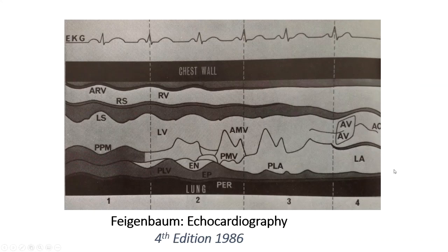And in the 70s, when I was a medical resident, this is what an echocardiogram was. If you ordered an echocardiogram, you got 4 strips of strip chart paper, one that went through the left ventricle, one that went through the valve, one that went up by the outflow tract, and one that went through the aorta and the left atrium.